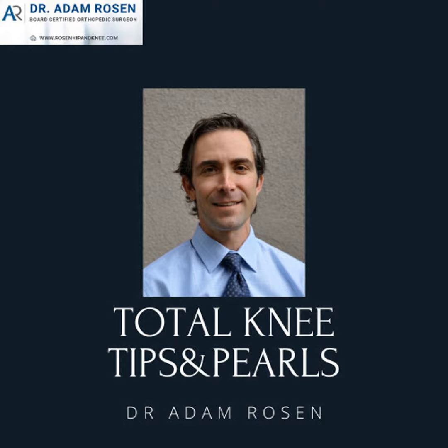So in today's world, it's very easy, right? We just send someone for a bone density test. You get the DEXA scan, you have this number. It's non-invasive, and it's reproducible, and it's a great way to follow patients. But back then, this is their way of dealing with what they had, which was x-rays, and trying to determine who may and may not have osteoporosis, or that in between what we now refer to as osteopenia.